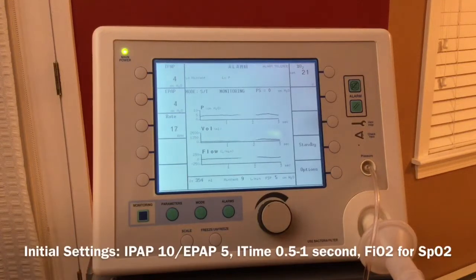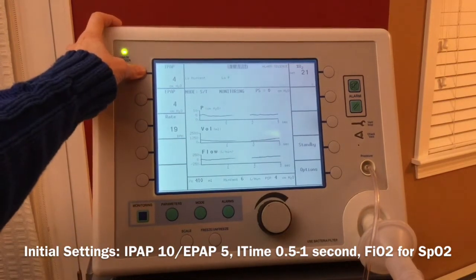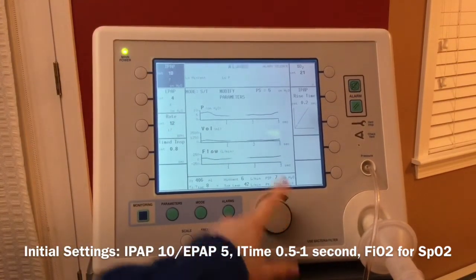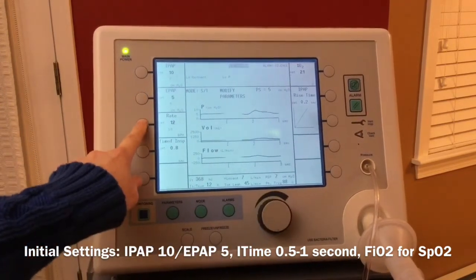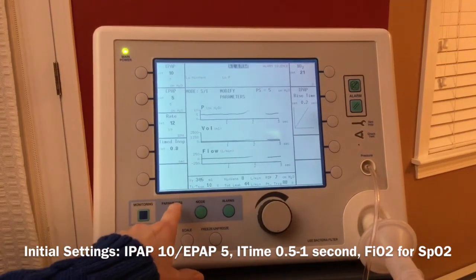And as I said before, a standard starting point for BiLevel is about 10/5. So I'll put those in. I actually have to go into parameters for this machine here. So that's my inspiratory pressure of 10, my expiratory pressure of 5. I'll set a normal respiratory rate or equivalent to whatever the patient is doing.